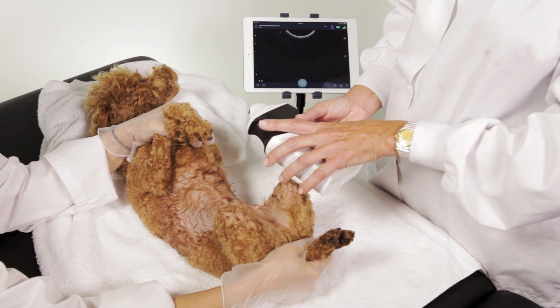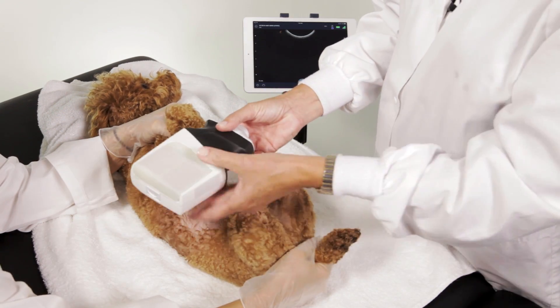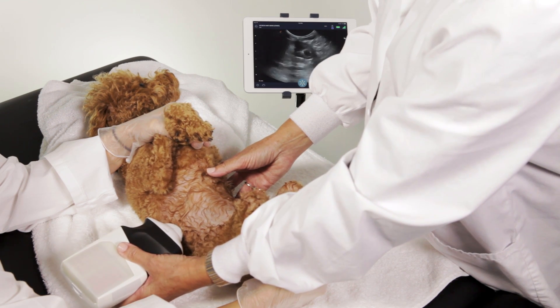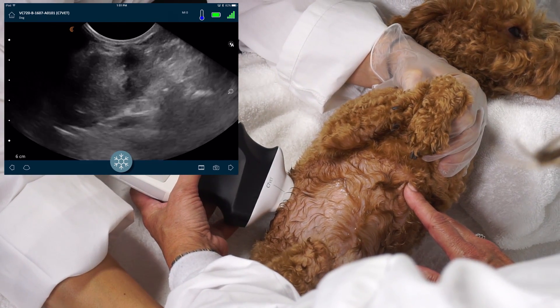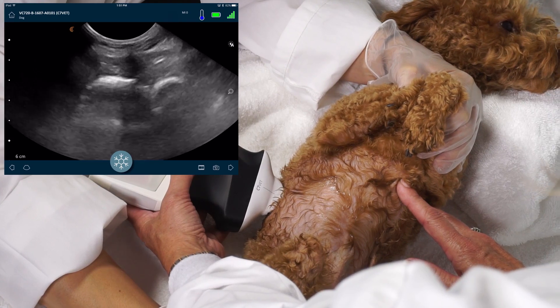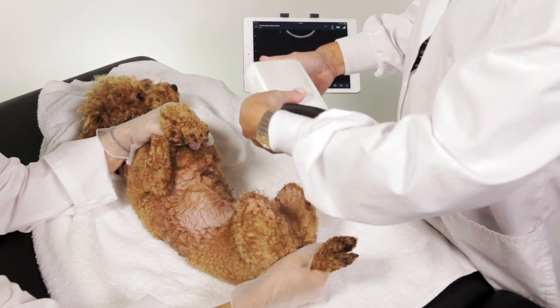The next spot we're going to examine is the hepatorenal area. If there is fluid in the abdomen, this is where it's going to go — this is the most dependent part. So we have a little bit of kidney here. We're going to scan all the way through and then all the way out. We're looking at the space between the right kidney and the liver. I'm saving time by not changing the depth.